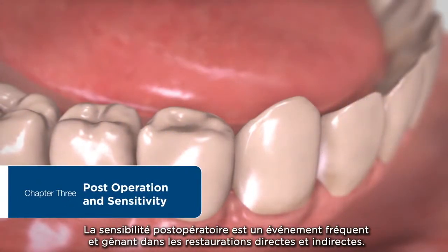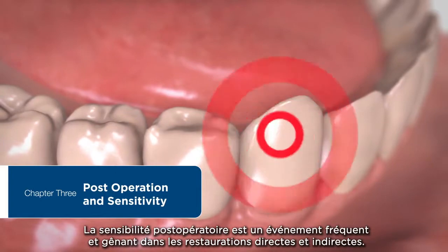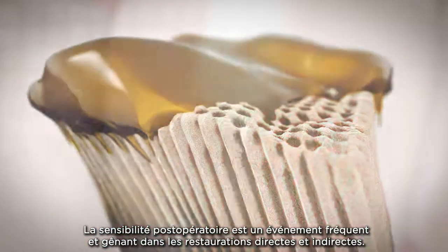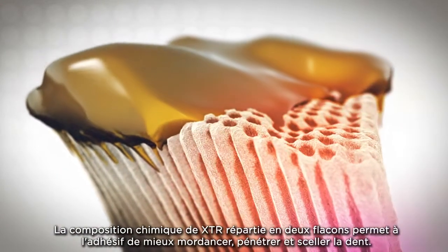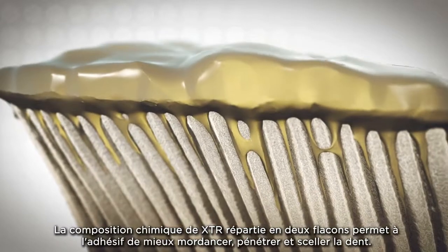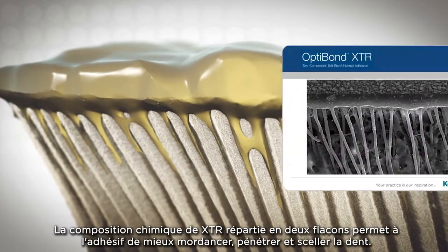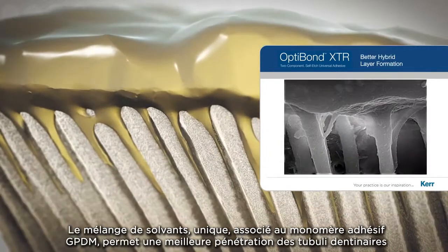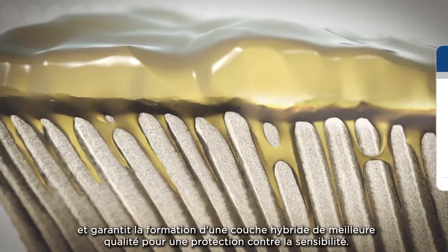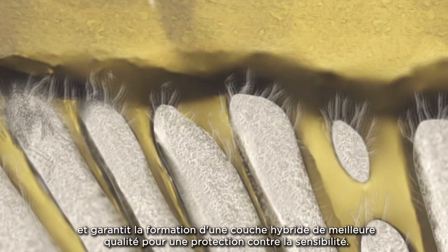With direct and indirect restorations, post-operative sensitivity is a common, troublesome event. XTR's two-bottle chemistry allows the bonding agent to better etch, penetrate, and seal the tooth. The unique solvent blend, along with the GPDM Adhesive Monomer, enables better penetration of the dentinal tubules and ensures a better hybrid layer formation to protect against sensitivity.